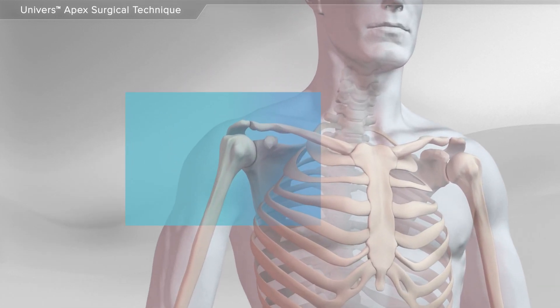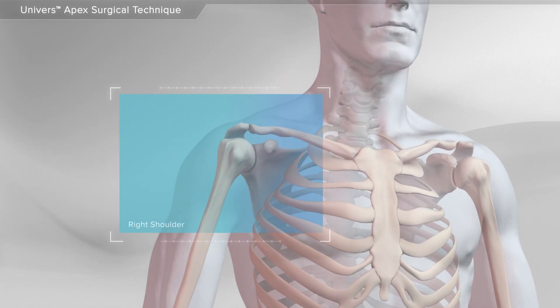In this animation, we will show a shoulder replacement surgery due to arthritis using the Universe Apex Total Shoulder System.